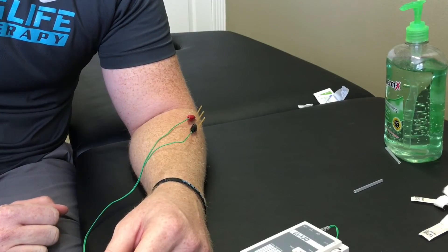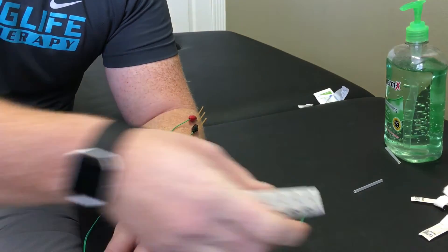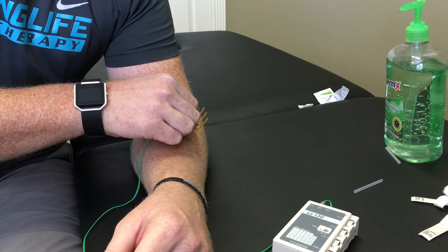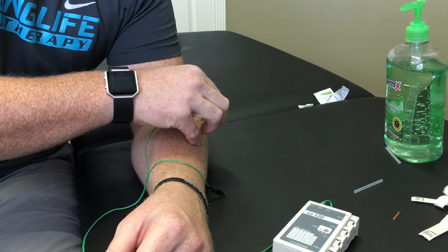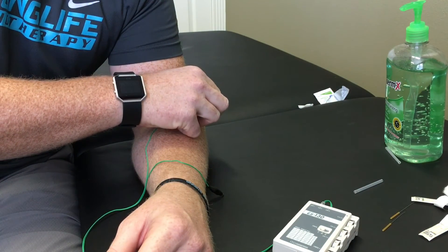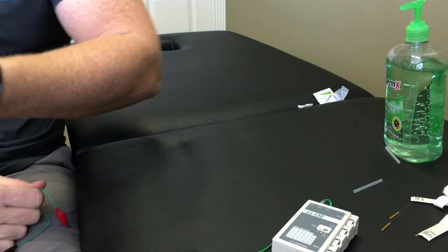Alright, time's up. I'm going to go ahead and take these needles out. That's it. It usually feels better and looser immediately after needling. You'll also get some aching which lasts a day or two and isn't too bad.